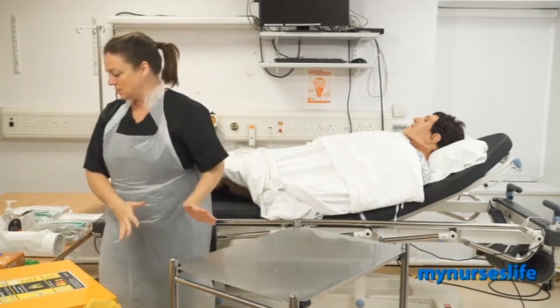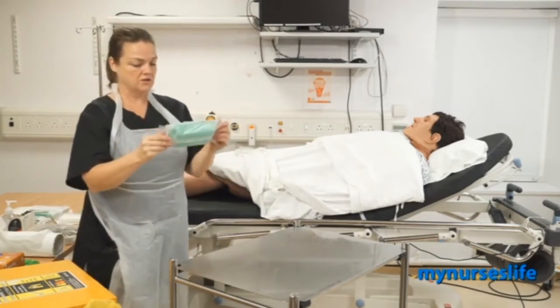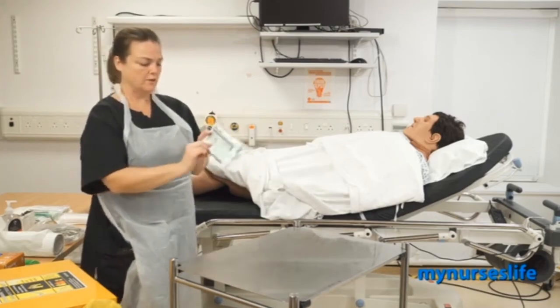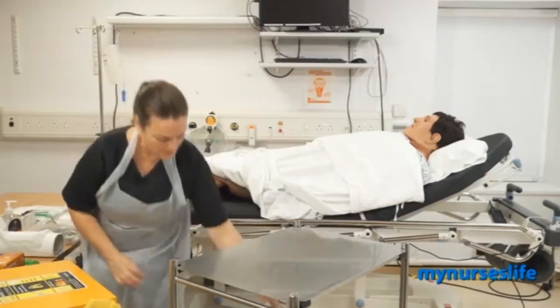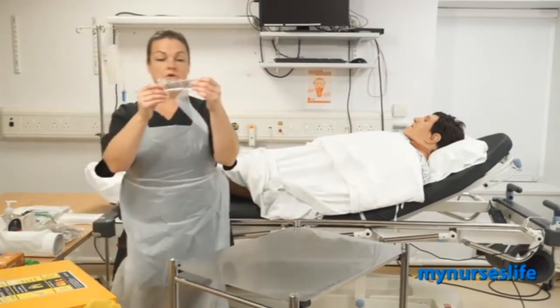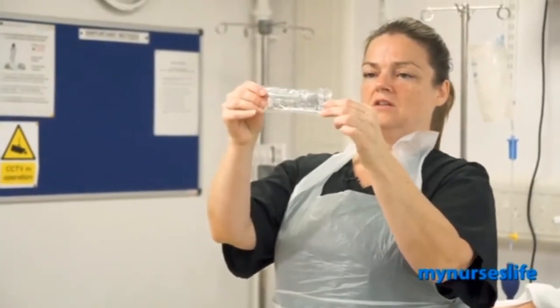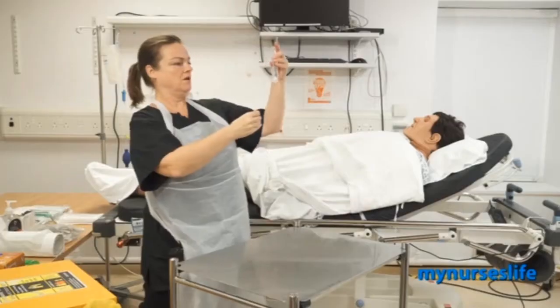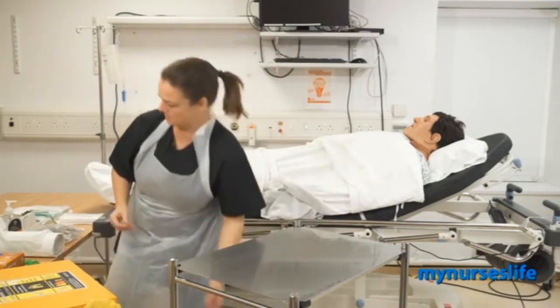So the trolley, I would assume now, is dry, and I'm going to choose a dressing pack to do the procedure with, and this one's intact and it's in date till July 2022. So I'm happy to use that one. And I'm going to use some cleaning agent, which is Normasol. It's just normal saline, and that is clear. The sachet's intact and it's in date till 11/20/20, so I'm happy to use that one.